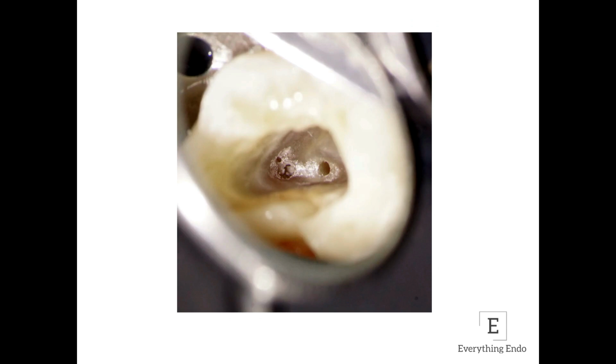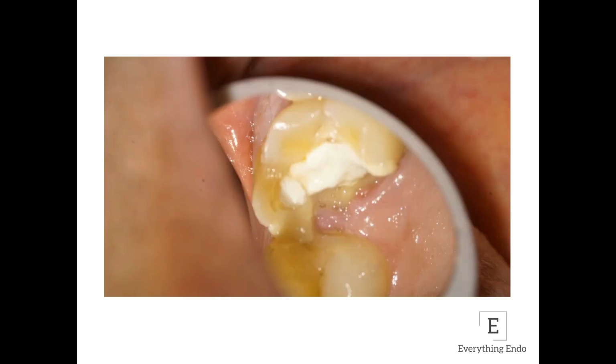This is the MB2 canal located and shaped, but sadly we could not finish this case because in the following visit the patient reported with a fractured palatal tooth structure. So this case was deemed unrestorable and we couldn't finish it.